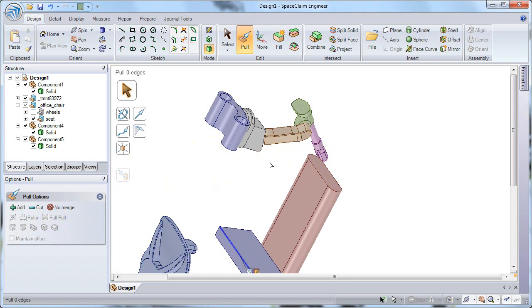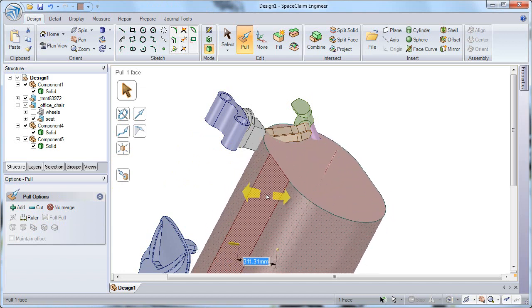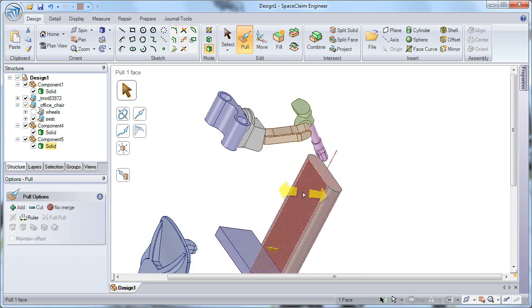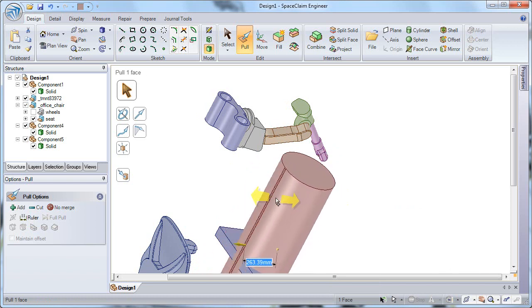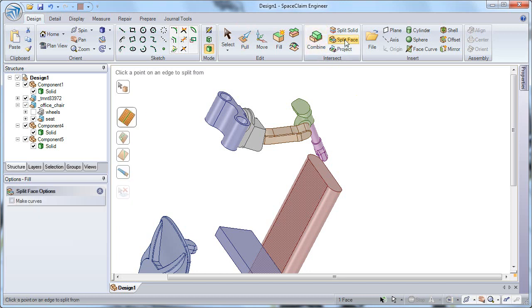Now I'd like to, so you can see that as I pull on a face of that slot, it's going to maintain that slot association the way that it was created. But I can right click and remove association to prevent that association, and now when I pull on that face, it just pulls on it as SpaceClaim would handle any face on geometry. So I'd like to now split this mount to create two separate cylinders. So let's choose split face and split the top face of that part.